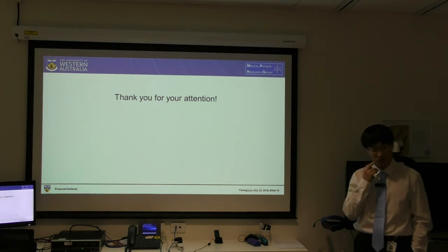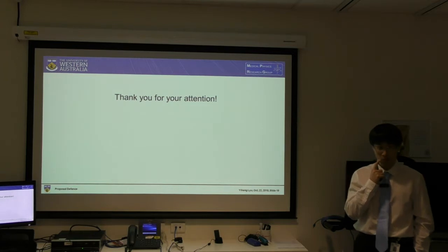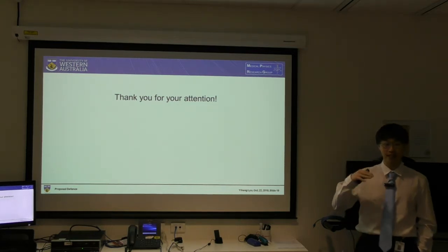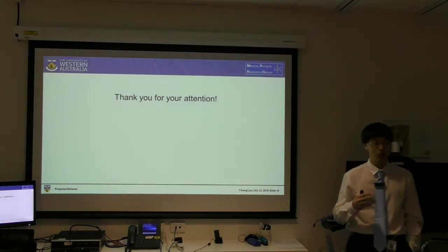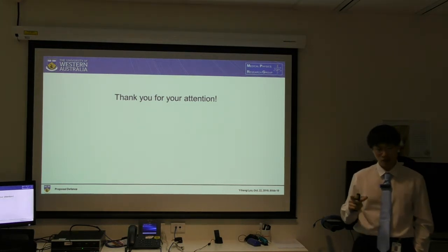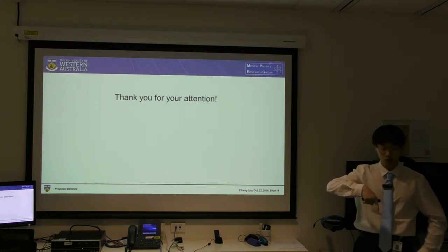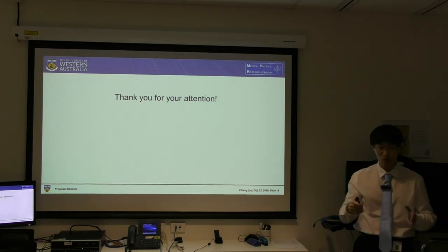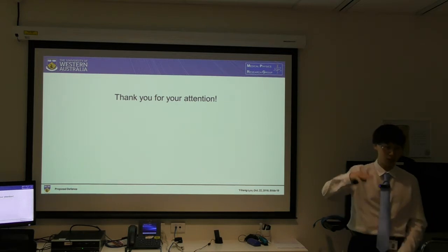Because you're using an EPID, the arm itself is actually not that stable. Yeah, exactly. So how do you handle this? The EPID is attached to the gantry and there's gantry sag. Fortunately, if we are using the same gantry angle, then at a certain gantry angle I rotate the collimator. So all the relationships I'm going to find at this gantry angle have nothing to do with the gantry sag.